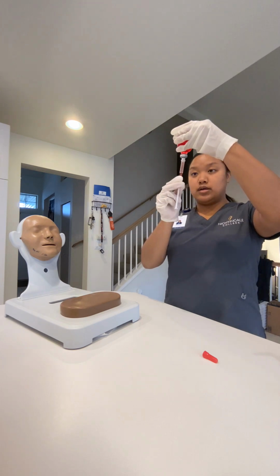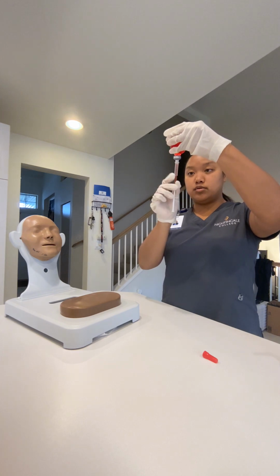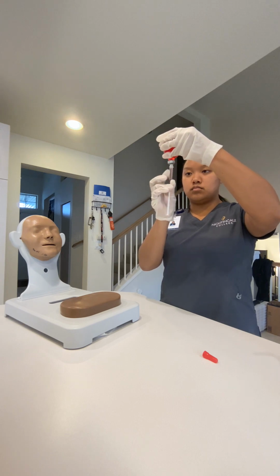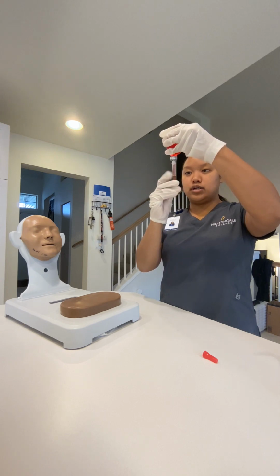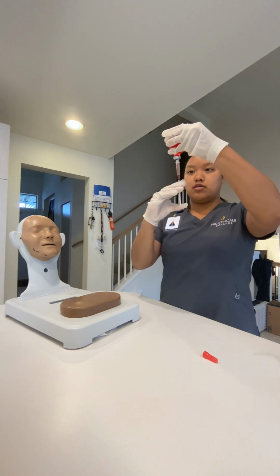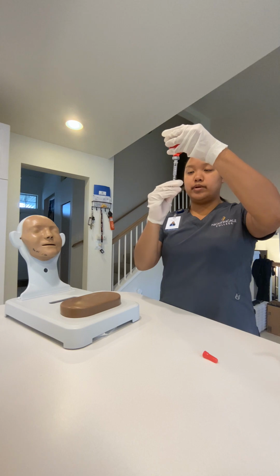There you go. Let me check to see if there's any bubbles. There's one little bubble, so I'm just gonna tap, tap, tap, tap. I see one little bubble, so I'm still tapping. Okay, so now because there was a bubble, we wanna make sure there's no bubbles when we're doing this.